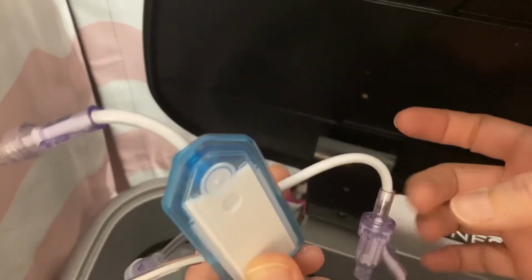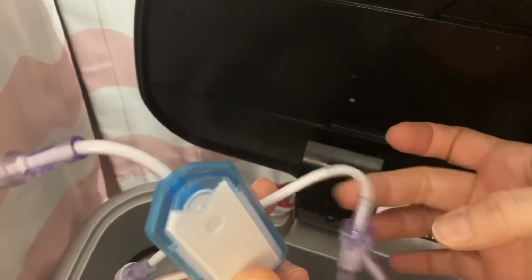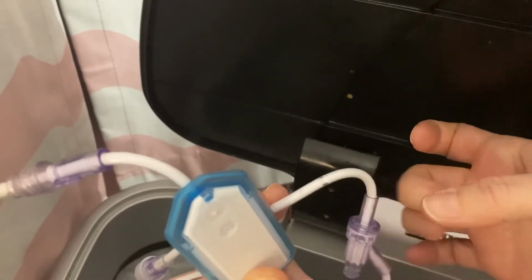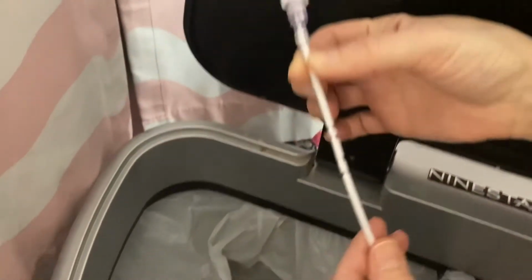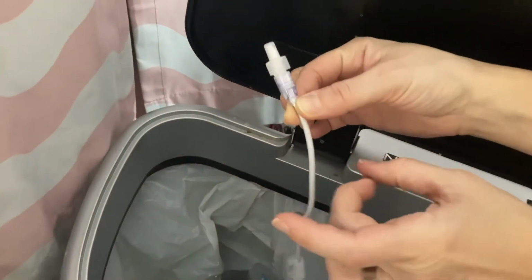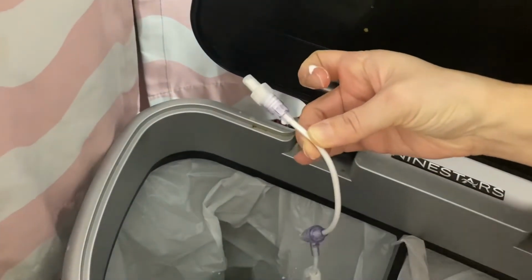Sometimes air bubbles can get caught in this connector piece. I flick this area to make sure I get any bubbles that can be primed out. The filter is designed to catch and keep these bubbles from getting to her. Sometimes small ones develop past the filter. Those won't hurt her. Only large ones, like longer than a foot in length, could cause trouble.